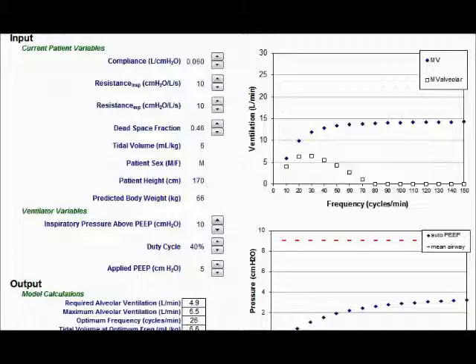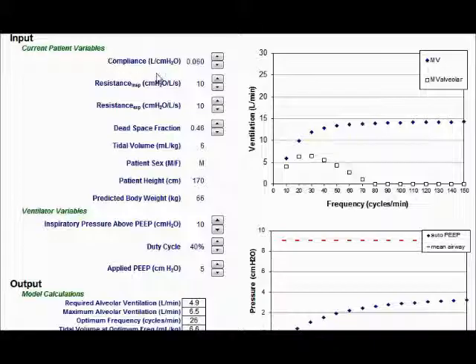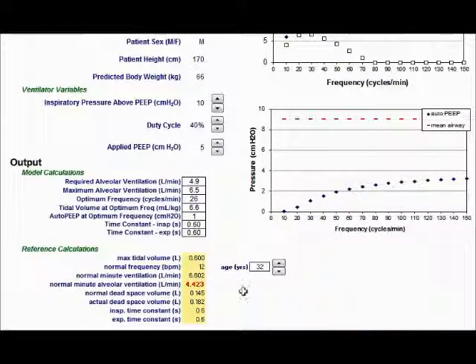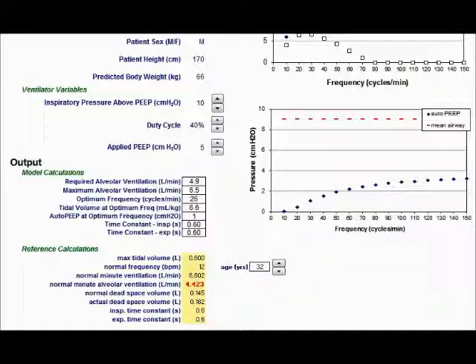So, how do I predict tidal volume when using pressure control? This screen shows a pressure control simulator, and we'll look at a couple things: the patient's compliance, our inspiratory pressure above PEEP, and then when I scroll down, we're going to look at the max tidal volume delivered. This is based on the mathematical principles of pressure control.